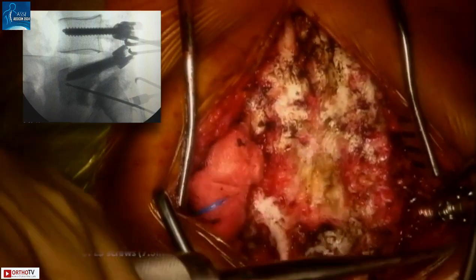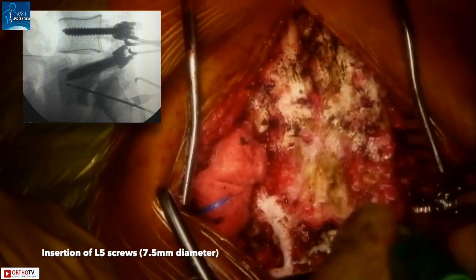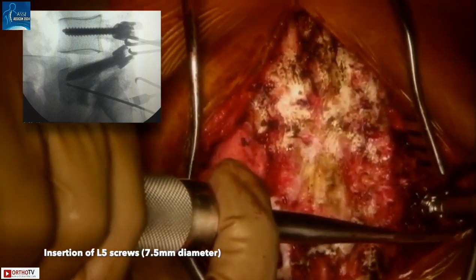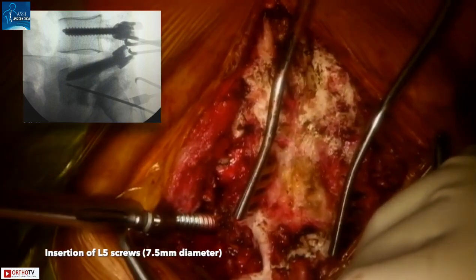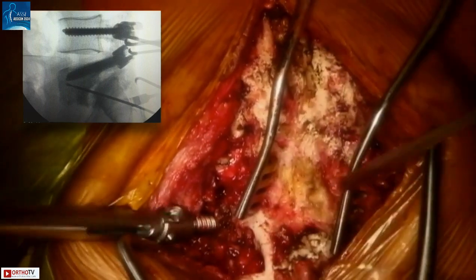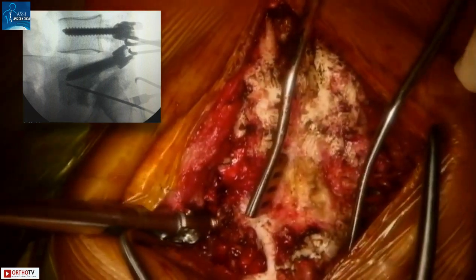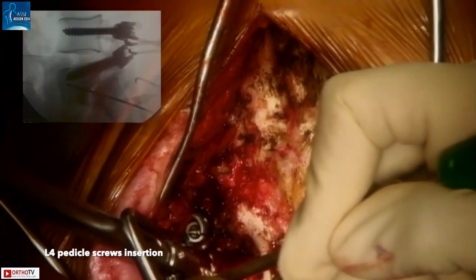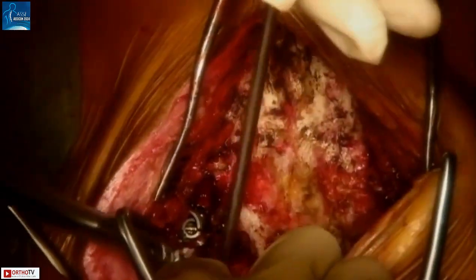Larger diameter screws were inserted in the pre-existing L5 pedicle screw trajectory. These were 7.5 mm screws. We found that the insertional torque was quite good on the left side but not so good on the right side, and therefore we inserted additional bilateral L4 pedicle screws.